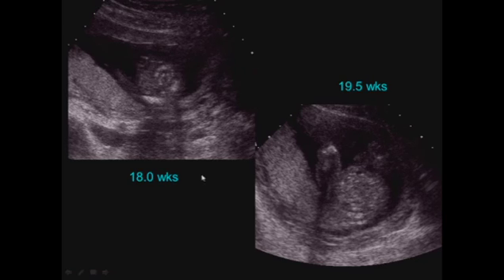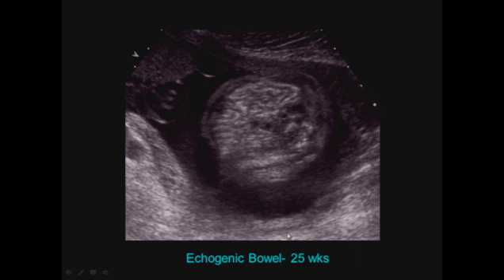Here's a case that we followed at 18 weeks. We can see the echogenic bowel down in the pelvis, and at 19 weeks we can still see the echogenic bowel, and at 25 weeks a tremendous amount of echogenic bowel, presumably all related to swallowing of intraamniotic blood.